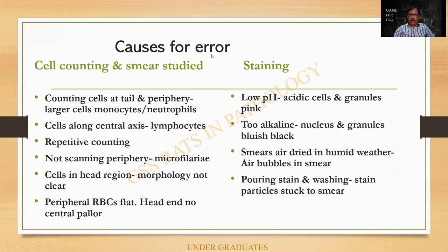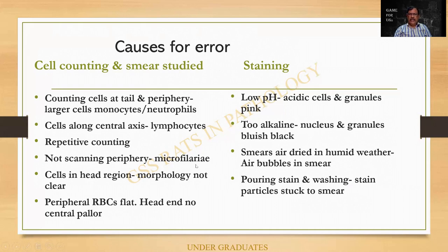There are some sources of error when we count. Counting cells at the tail and periphery will repeatedly include the larger cells. If I count only along the central axis, lymphocytes will be over-represented. I can also make the mistake of not scanning the periphery — I am supposed to scan the slide under low power or even high power to rule out parasites such as microfilaria. Microfilaria is an exam slide kept under high power, not under oil immersion. Cells in the head region are not spread out so morphology cannot be clearly made out. In the peripheral region RBCs are flat, and it is only at the junction that the central pallor and peripheral rim of hemoglobinization can be made out.